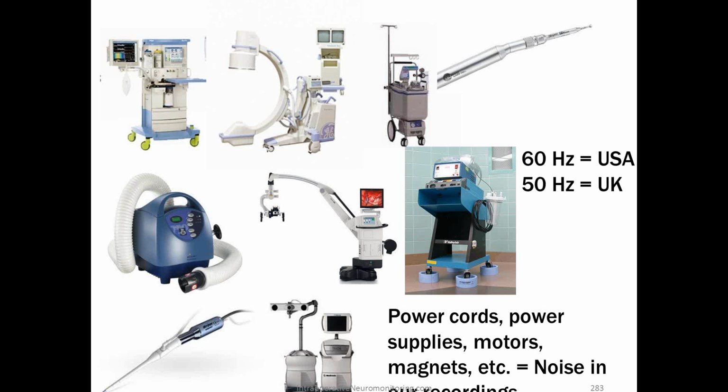Things in the OR that can cause this 60 hertz, or 50 hertz in the UK, are things that we're all familiar with seeing: the drills, the fluid warmer, the C-arm, the anesthesia machine, Bair Hugger, navigation, scope, the bed itself. So anything that has a power cord or a power supply or a motor or magnets in it is going to add some noise to our recordings.